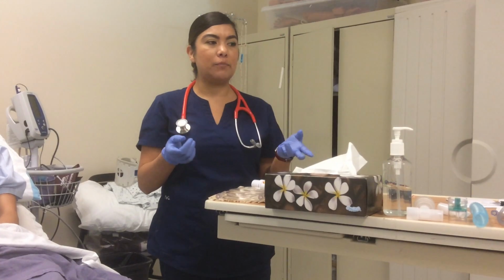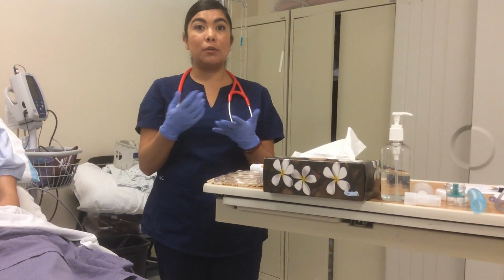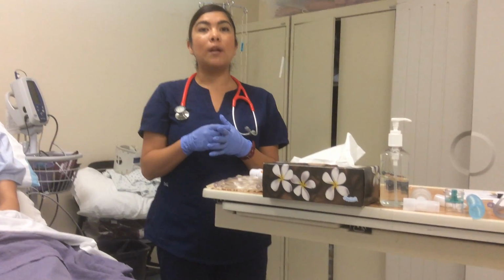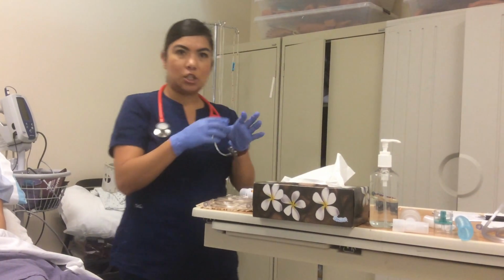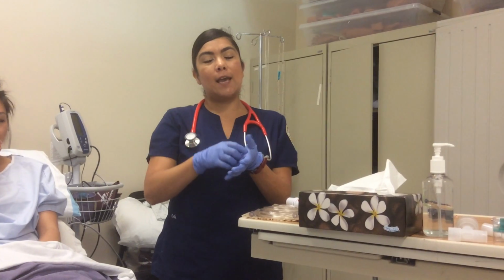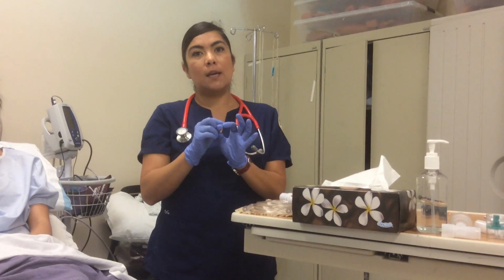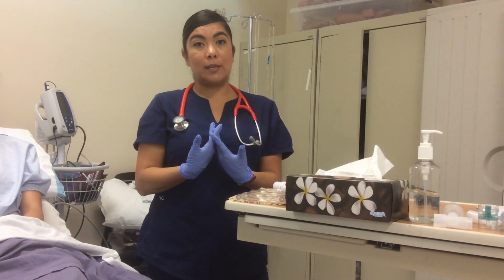Now, usually we have two separate mouthpieces. One of them usually has an indicator where you could change it, and it would have the little dots. If it's the dots, then that means that it's going to be breath actuated.